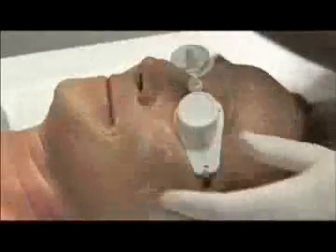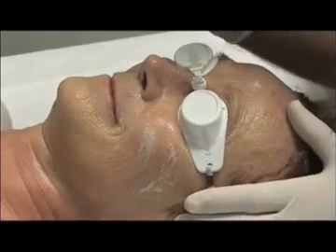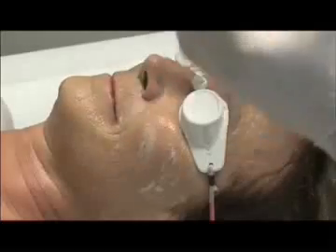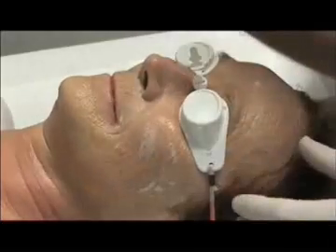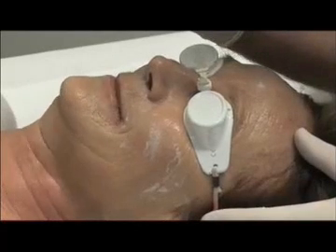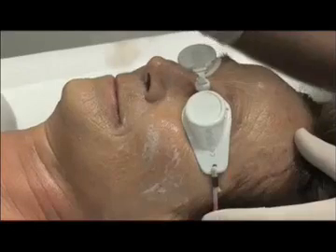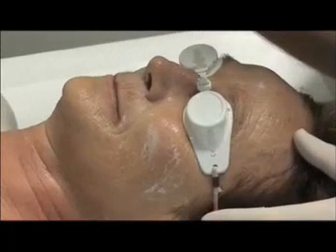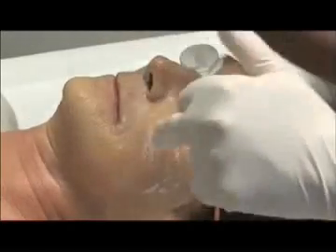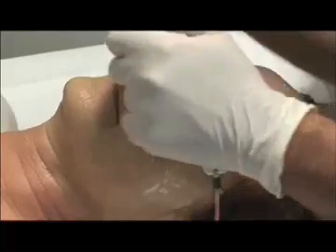Let's start. The first impact will allow us to test the pain and enable the patient to know what to expect before continuing. This is what we will be doing all over. The upper lip is the most painful part of the face to treat. As I move towards the center, the pain will increase.